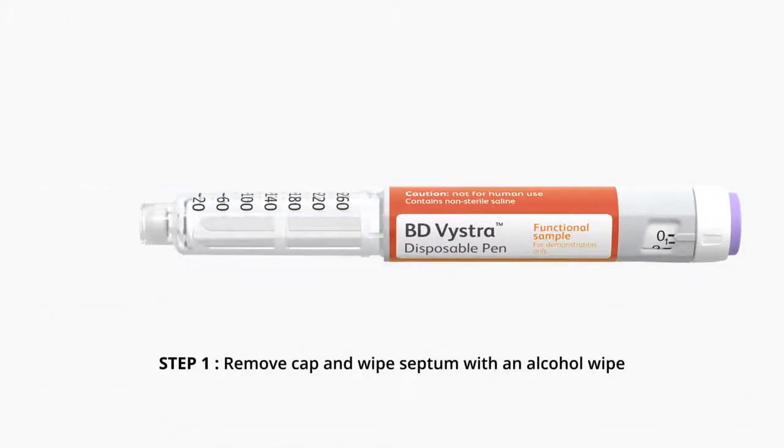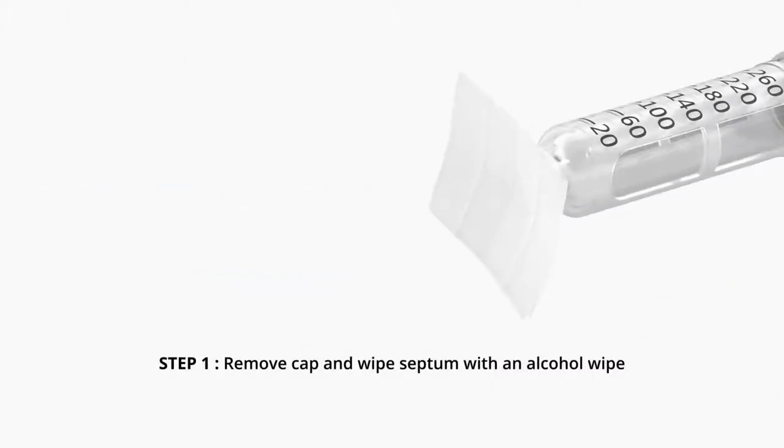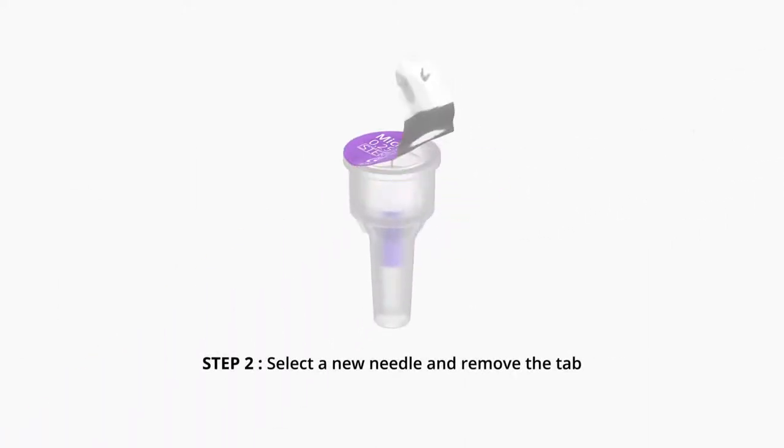Step 1. Remove cap and wipe septum with an alcohol wipe. Step 2. Select a new needle and remove the tab.